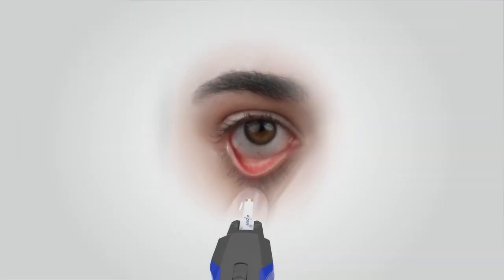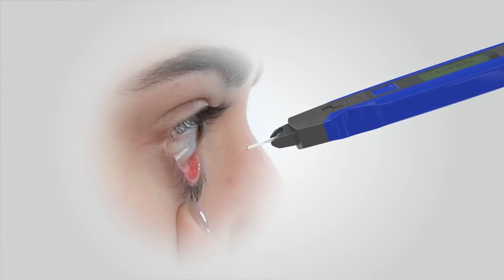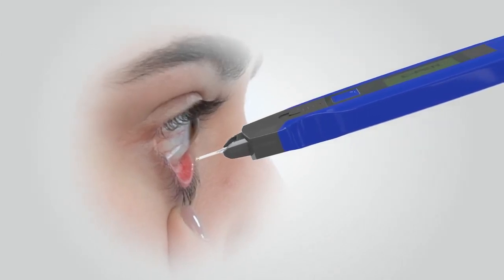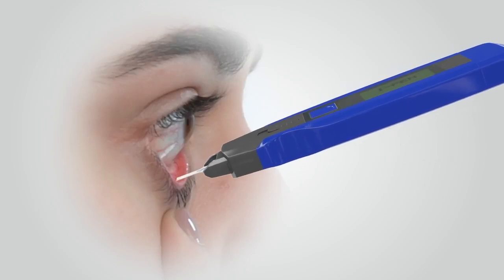Turn on the iPen by pressing the main power button. With the patient's lower eyelid held, position the tip of the single-use sensor just above the inverted lower eyelid with the LCD screen facing upwards. Approach at a 30-degree horizontal angle and gently lower the end of the single-use sensor onto the conjunctiva on the inside of the lower eyelid.